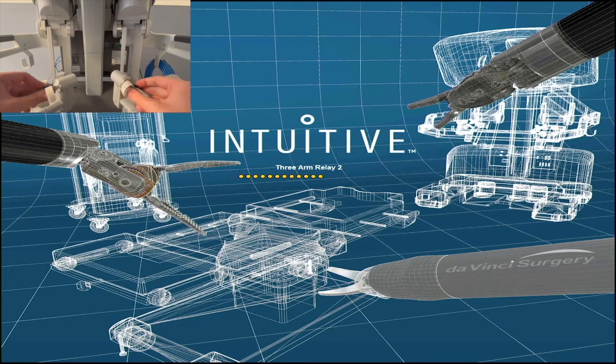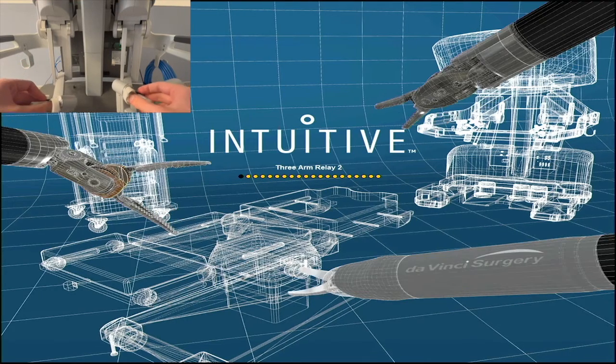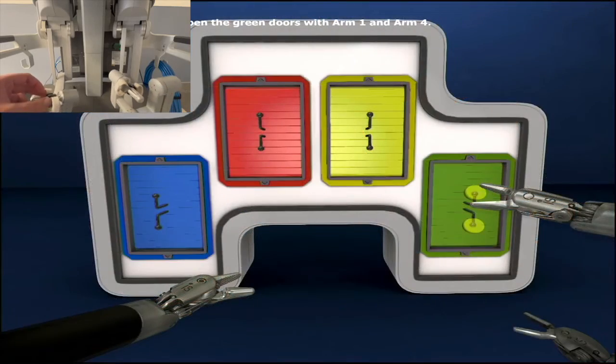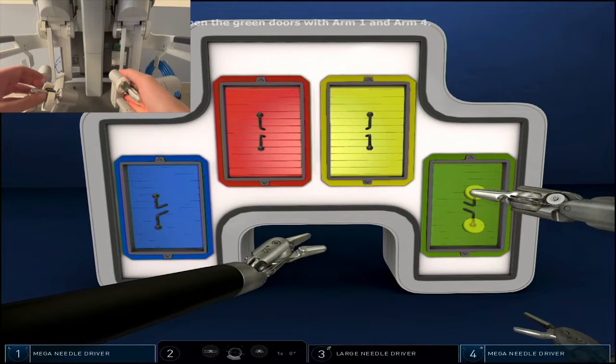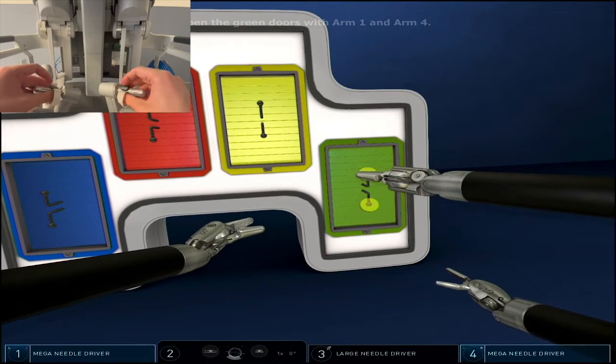Hello everyone, this is a video tutorial of the three arm relay number two exercise. As with any three arm relay exercise, the things that you should be most careful about is maintaining all three instruments within the field of view.